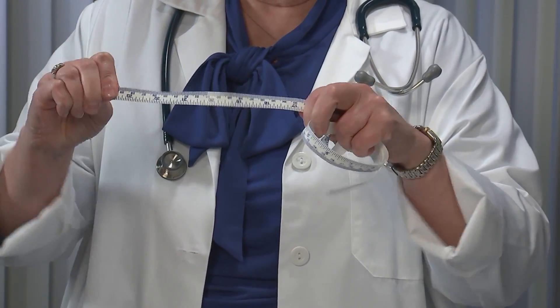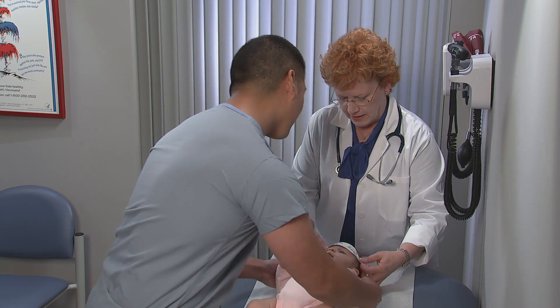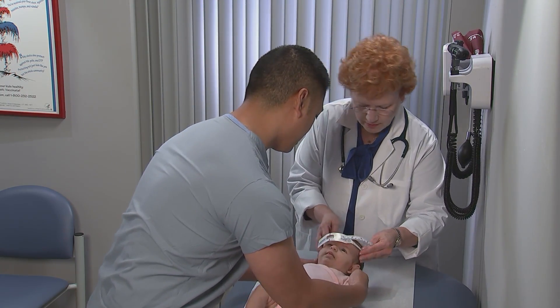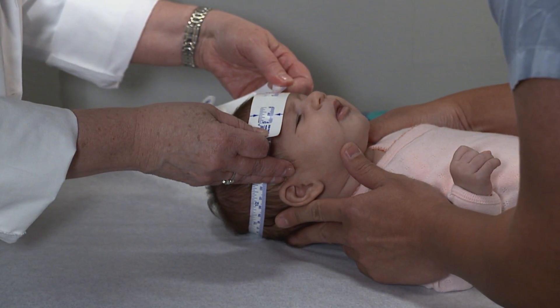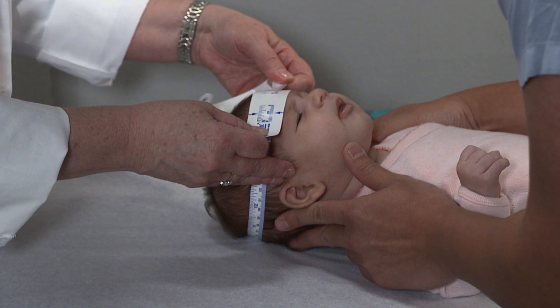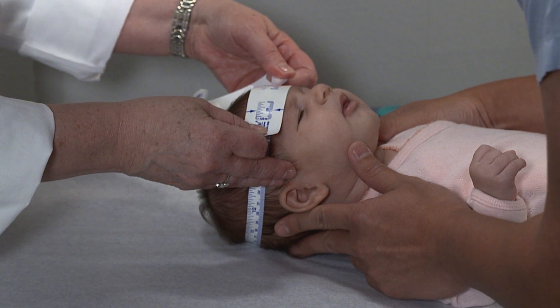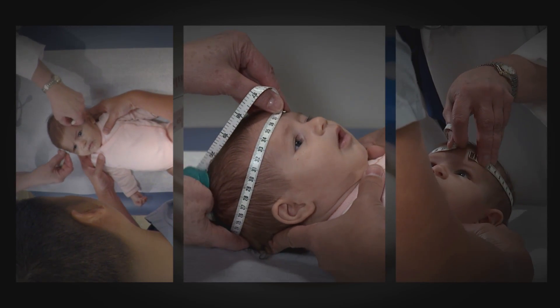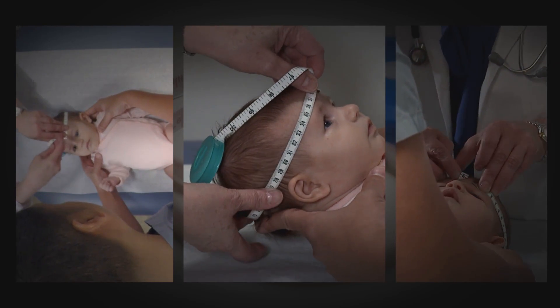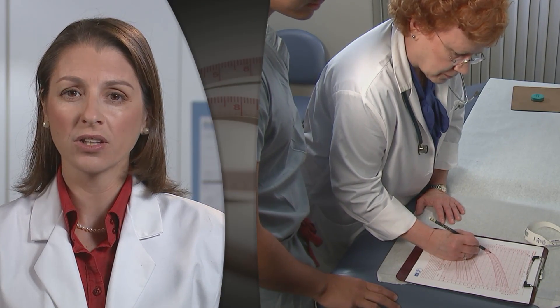First, start with a measuring tape that cannot be stretched. Next, securely wrap the tape around the widest possible circumference of the head — that's usually one to two finger widths above the eyebrow on the forehead and then across the most prominent part of the back of the head, as you can see here. We recommend that you reposition the tape and repeat the measurements three times. Record the largest measurement to the nearest 0.1 centimeters.